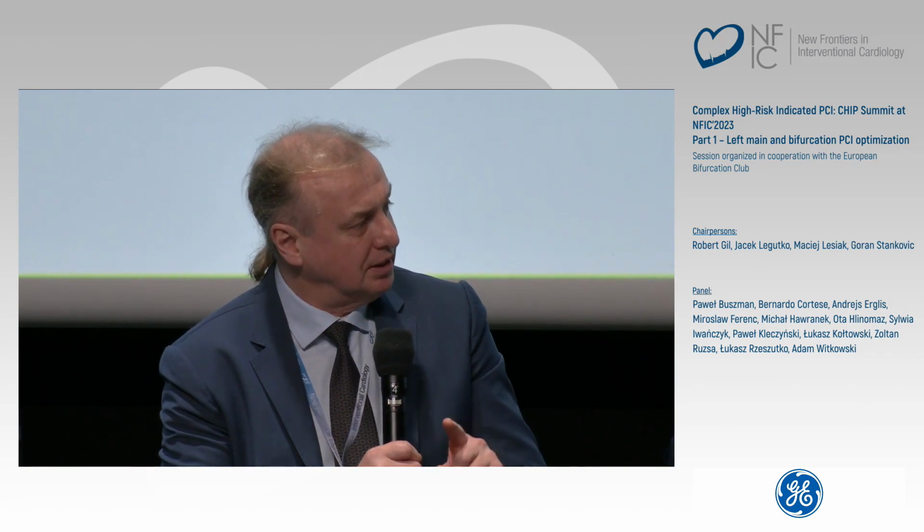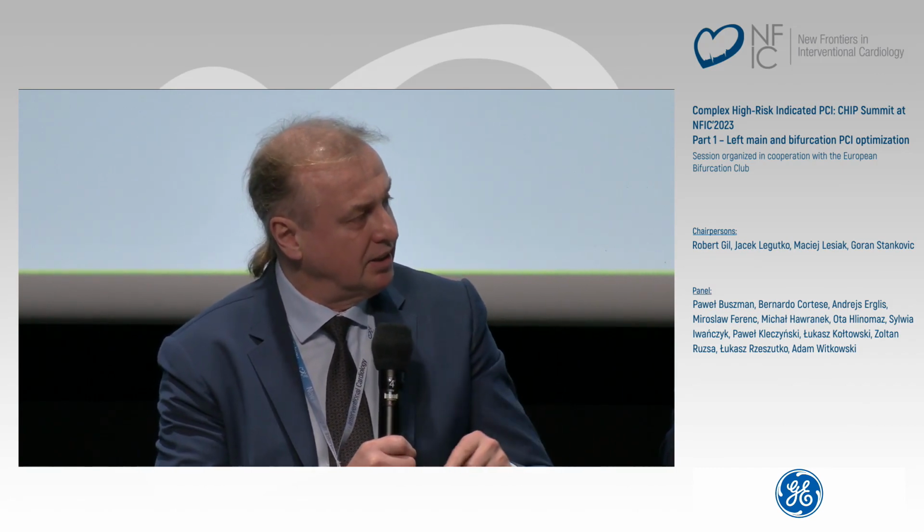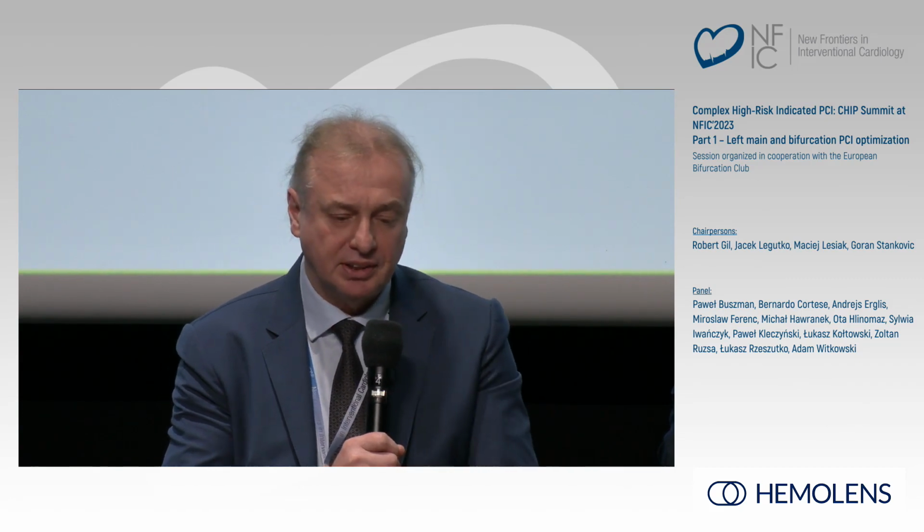And now I'm much more liberal to put a stent even in a calcified environment, because even if you are in big trouble, you can go back with IVL, and actually you can cut this calcium. But Goran, yes, of course before the IVL era, I would use a cutting balloon, mostly close media to media size, because then it works very well, and you can prepare the lesion, and it is a fantastic job done.